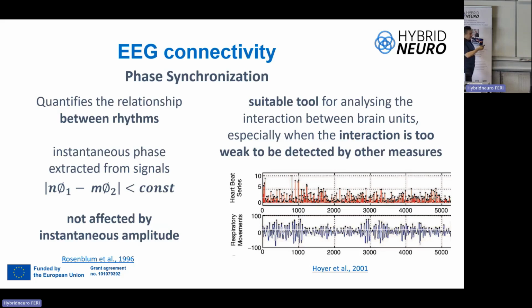But well, no problem, because my bachelor students are not here, so we can explain that what is important is the phase of both signals. And also the instantaneous phase of each signal can be calculated by several methods, but the most typical is the Hilbert transform.